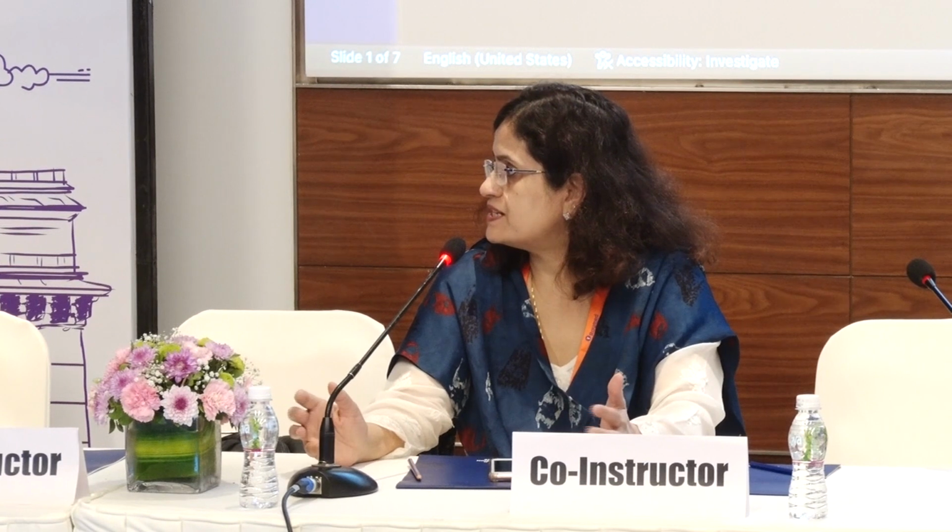Yes. Okay. So how much is the learning curve, since both of you are doing the GAT? Because I feel that you start with the goniotomy, because it is initial. It's a very easy procedure. Yes, but right. GAT does require some skills, and it has a steep learning curve. So how much and how did you proceed?